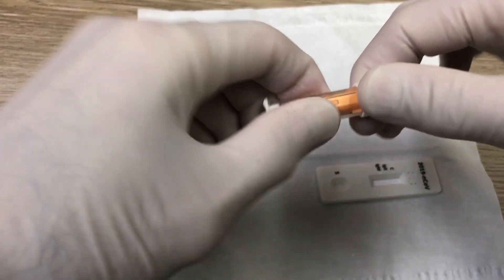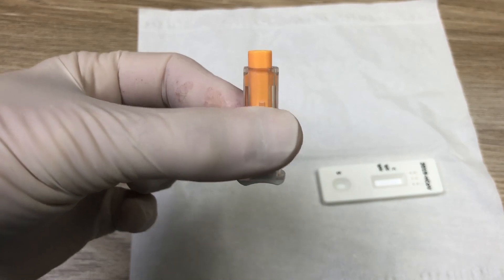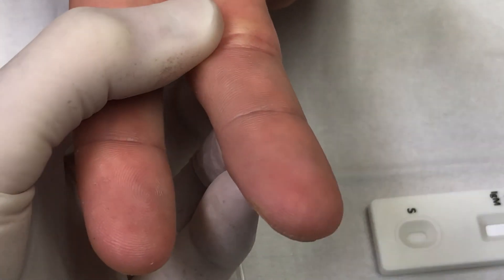All the tools are provided in the kit. The finger prick lancet is very gentle, so you have to press it firmly against the finger to be able to get a drop of blood.